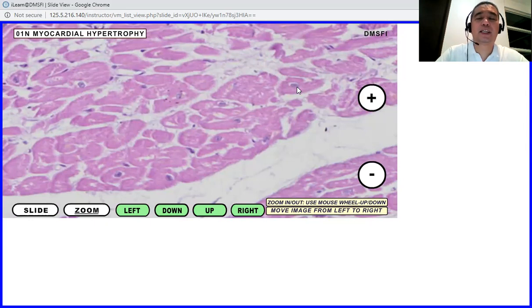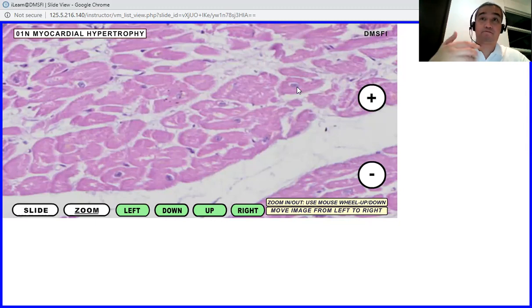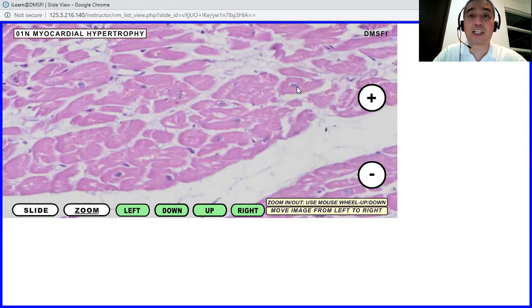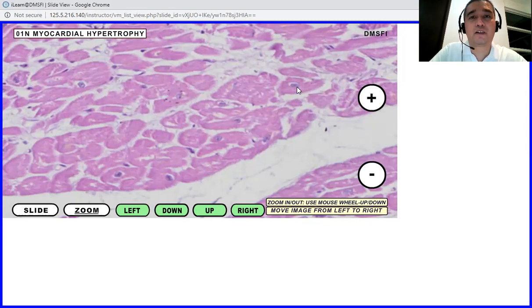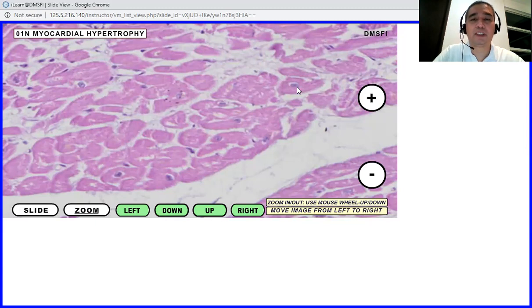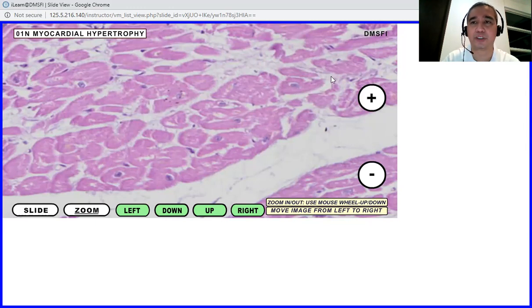On the other hand, if the cause for the hypertrophy would not be exercising, but presence of hypertension, the presence of faulty valves, then most probably it's pathologic. Okay, so we go to the other slide. I'm going to close this one.